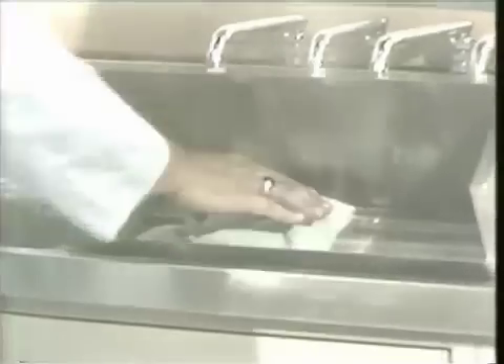At this point, we can shut off the running water, remove the two halves of our mold, and allow them to bench cure, or to get to room temperature on the bench top. I'll be back in just a moment and we'll show you what these molds look like after they're cool.